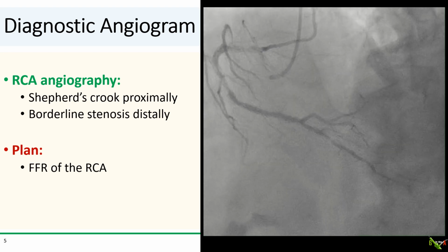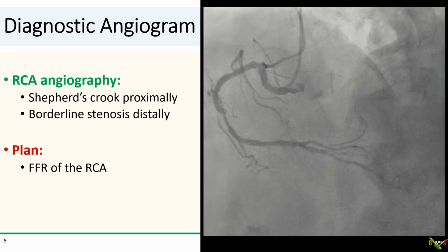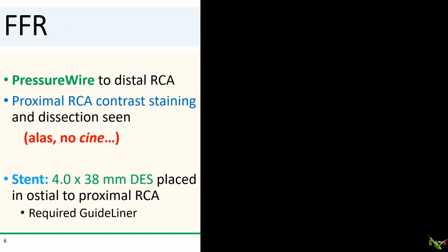We were on the fence about the significance of this distal lesion, so we decided to perform FFR to assess hemodynamic significance. And here is where things start to get interesting, and unfortunately, the cine images were not recorded here. We were actually able to get the FFR pressure wire fairly easily around the shepherd's crook into the distal RCA.